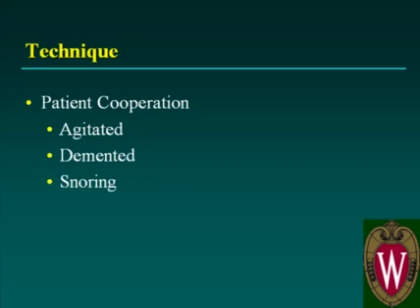The success of the technique depends on several factors, but it is most important that the patient can cooperate in some way. If a patient has had perhaps an acute brain injury, they may become agitated or demented and be unable to cooperate. Further, if they were to fall asleep and to snore, then useful information is difficult to obtain.